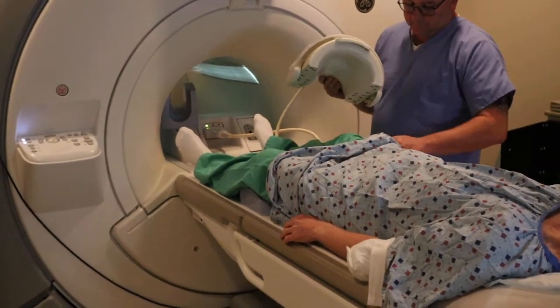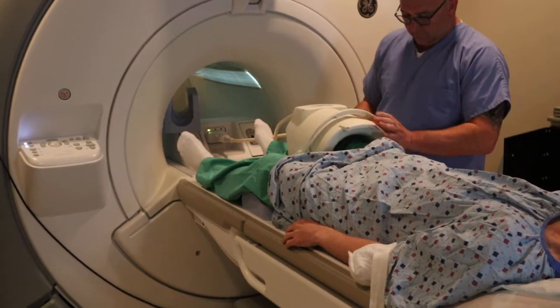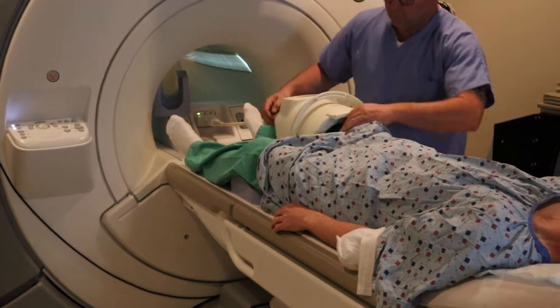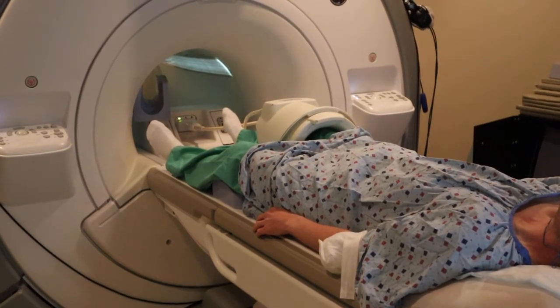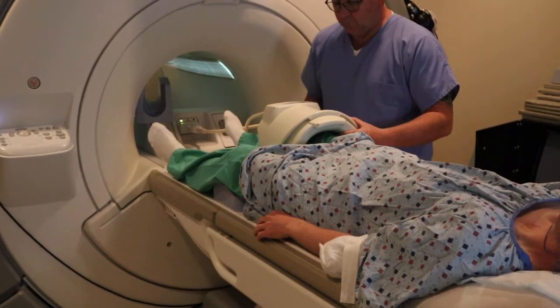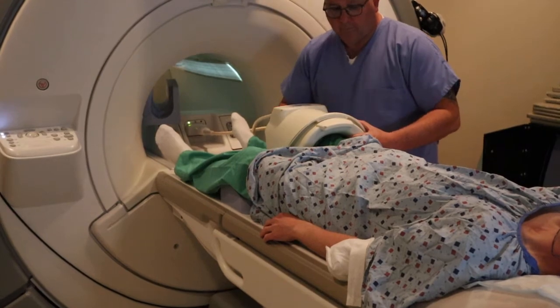You're going to attach the top piece of the eight-channel knee coil. You want to make sure that there's no scrub or gown caught within or between the pins of the coil, otherwise that will cause the coil not to work. The knee is very sensitive, so you want to make sure that there are stabilizers on the inferior and the superior aspect of the coil.